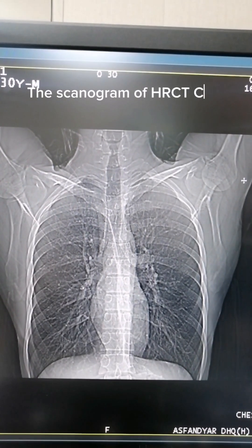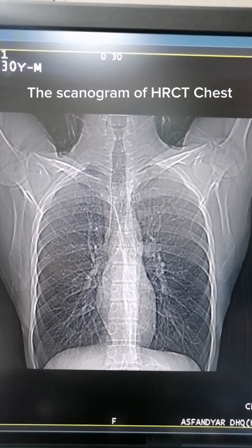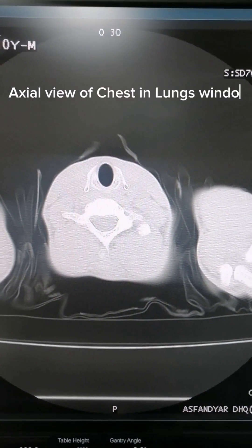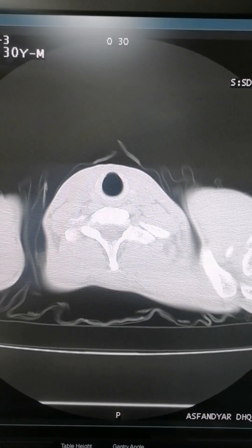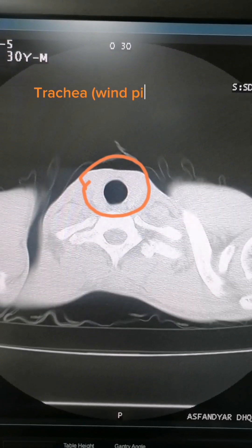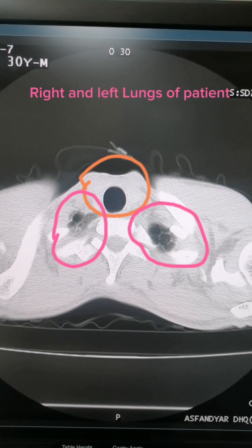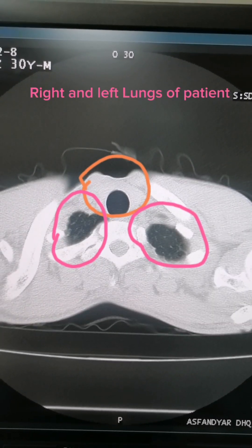The scanogram of a CT chest, axial view of chest in lungs window. Trachea, the windpipe of lungs, and the right and left lungs of the patient are visualized.